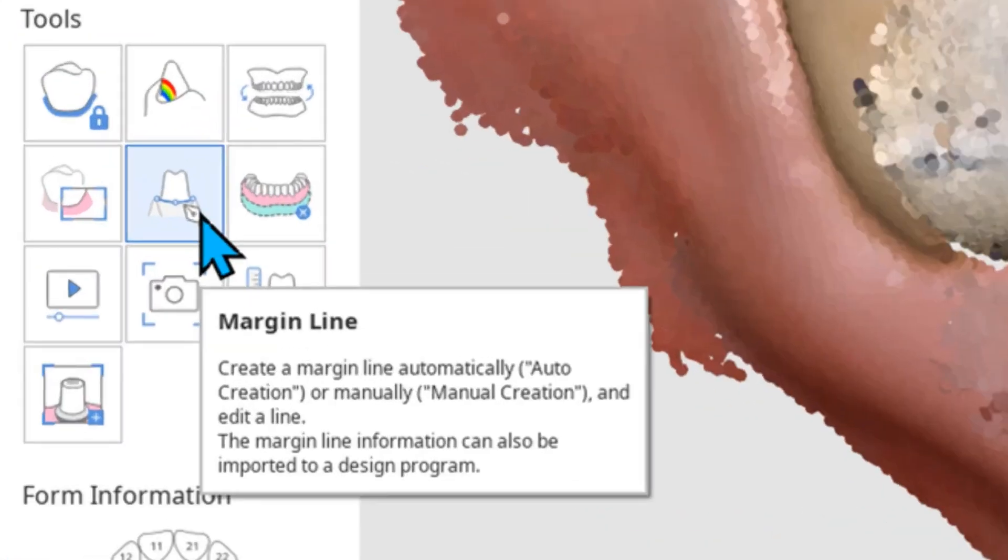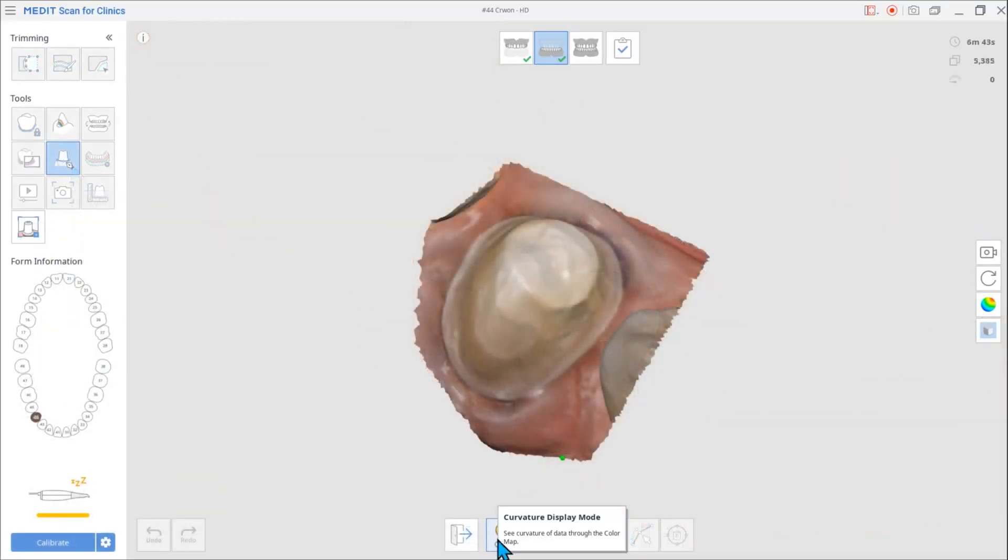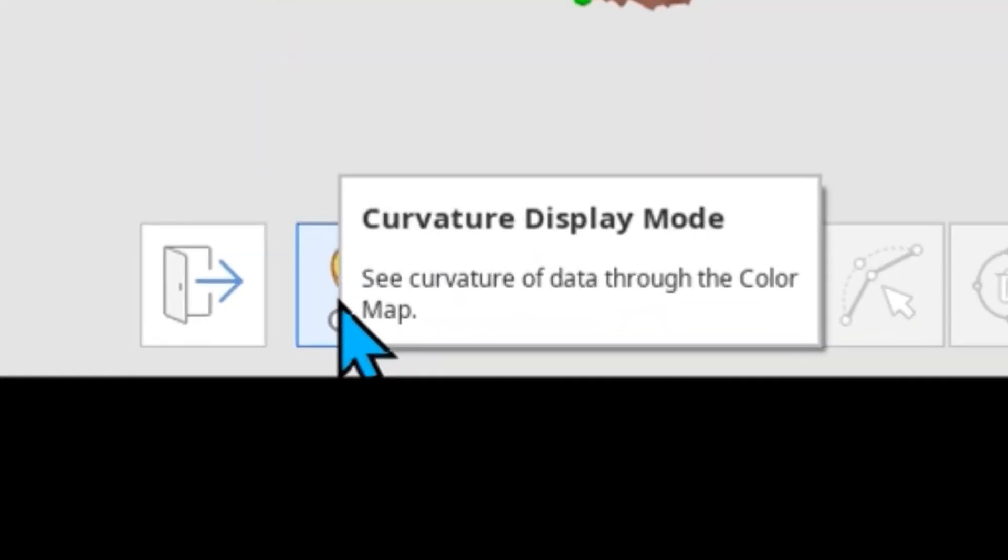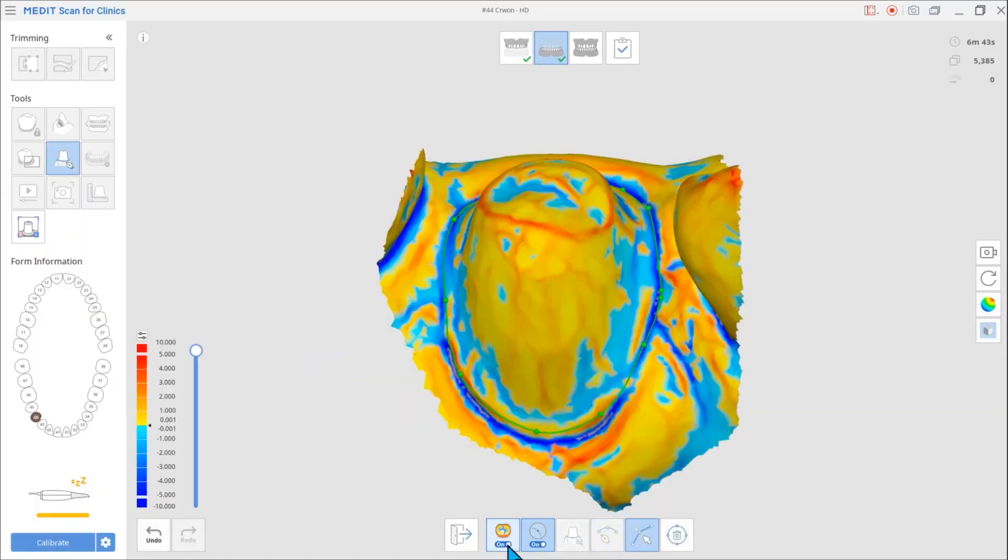Lastly, we added new functions to help margin line drawing. We added a function that displays the curvature of the data to help you draw more accurate margin lines.